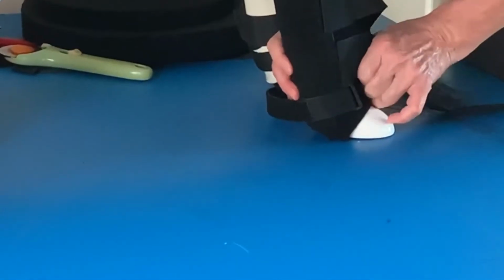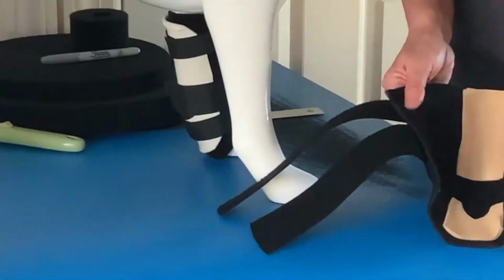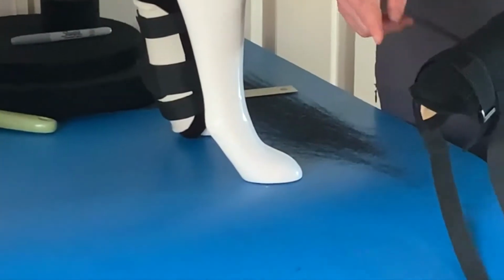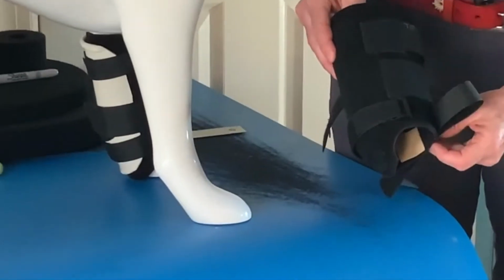Note that this brace has outer cinching straps, is padded on the inside for comfort, and also has a number of support straps on the outside to help shape the brace and stabilize the carpus.